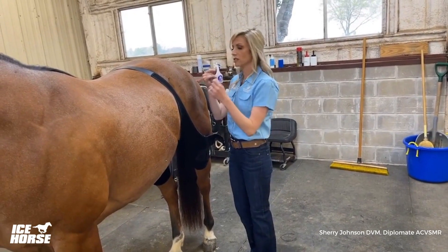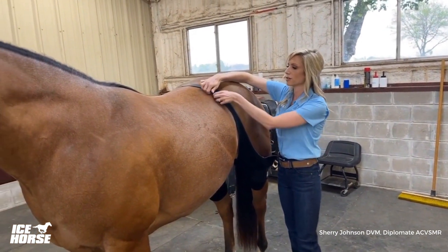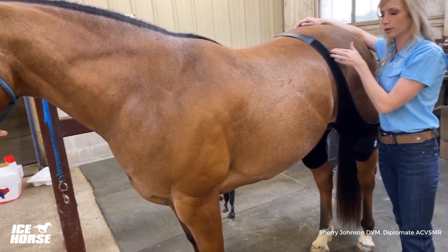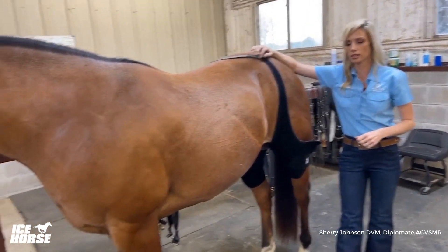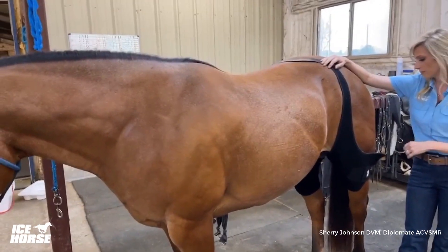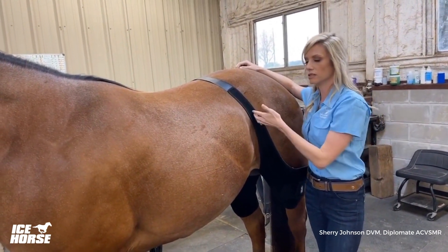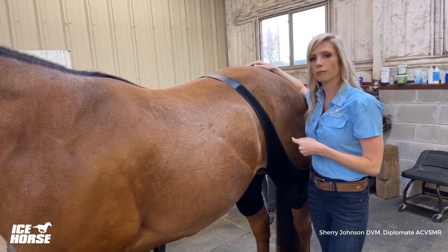For the best fit so the wraps aren't sliding or gapping, I always make sure the suspenders are pulled in front of the tuber coxae — that's the hip bone region. If it's not seated correctly, the ice will shift, it's not as comfortable for the horse, and it's just not as good a fit. You want that pulled up in front of the anatomy so the ice wrap sits in exactly the right location for the best anatomic fit.